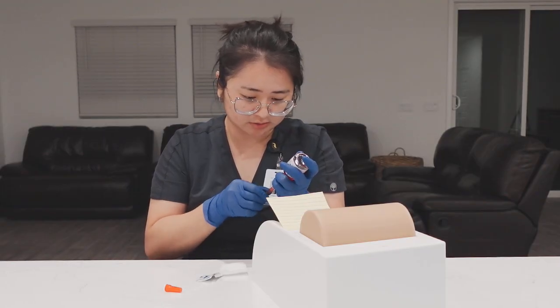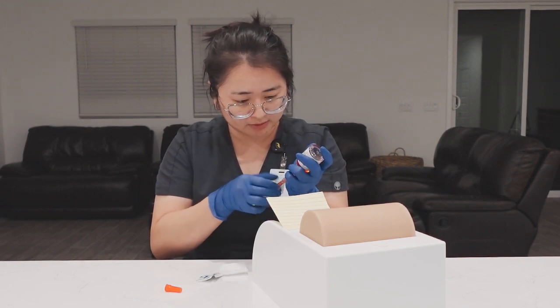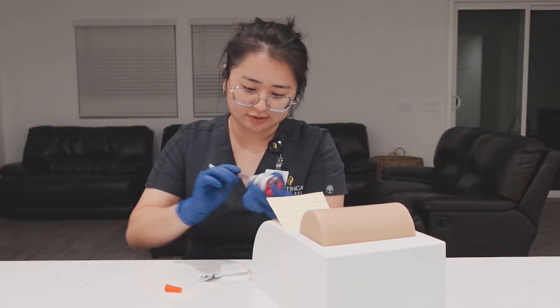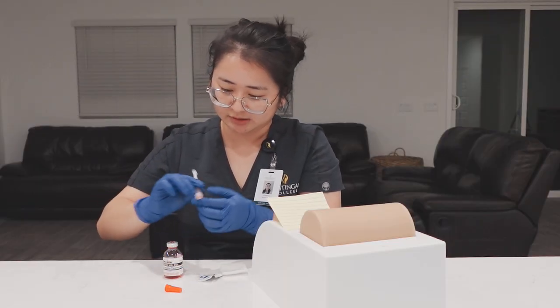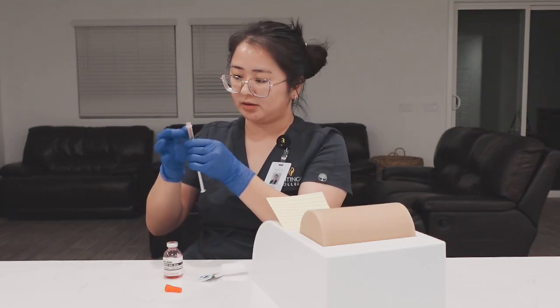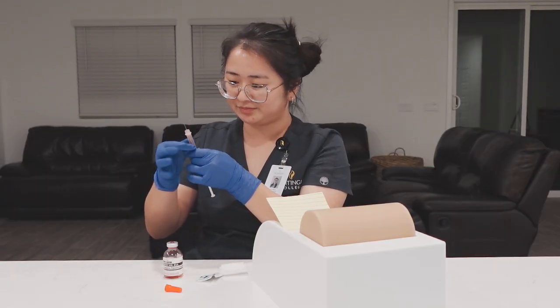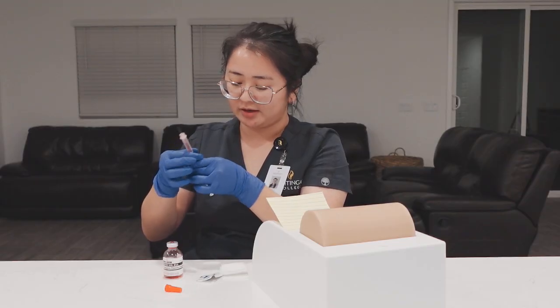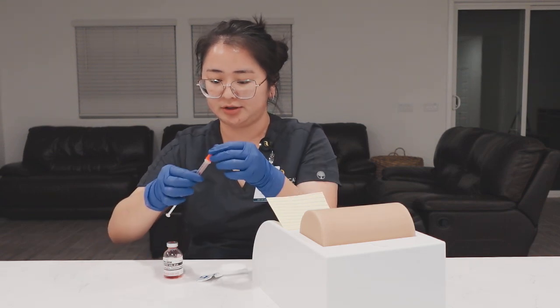All right, so do you see some air bubbles? And we're going to fix that right now. Also, I broke my vial, so there may be a bit of medication leakage. That's why it's on the top. Right, so we're going to get rid of any bubbles. All right, now there are no more bubbles, and we have 1 milliliter, so we're going to cap the medication, and then I will show it to you.